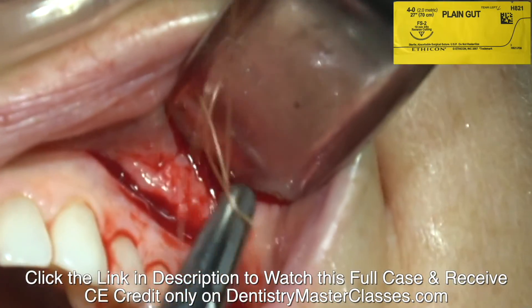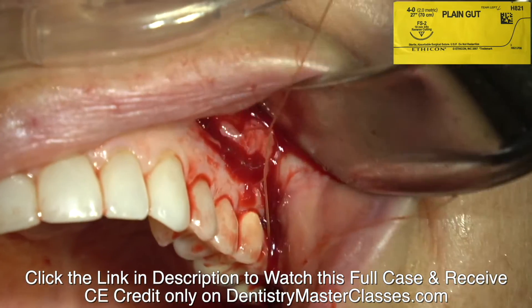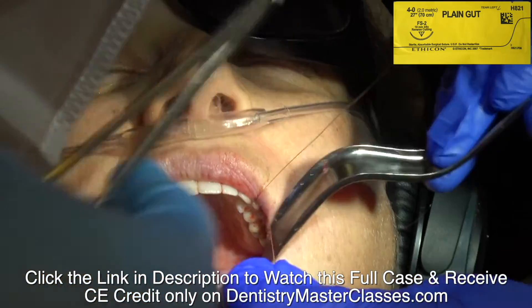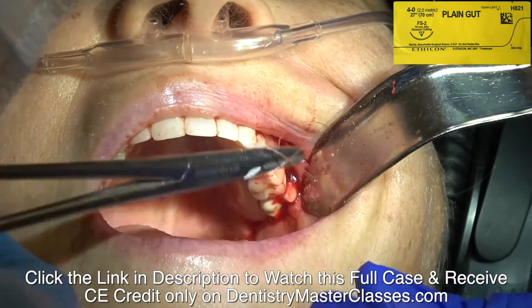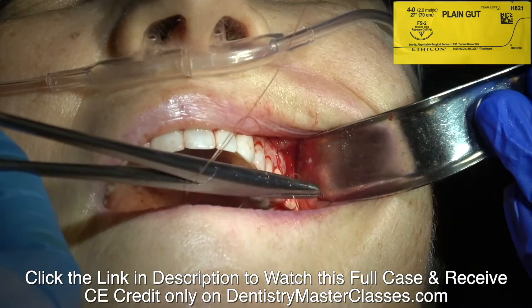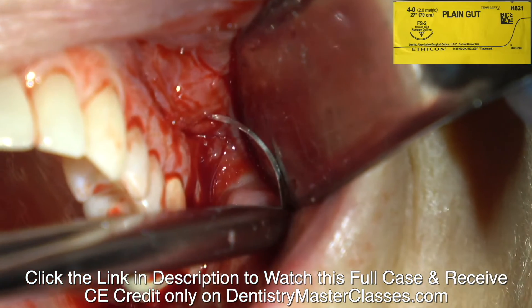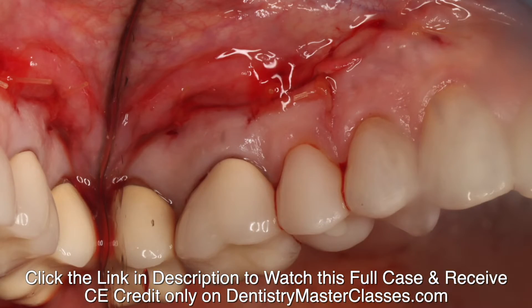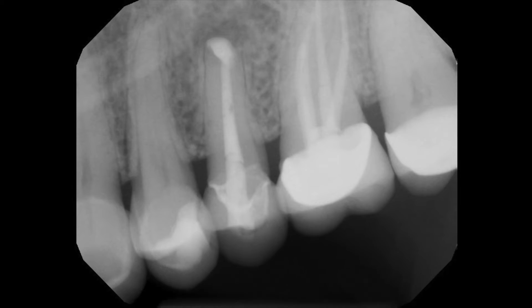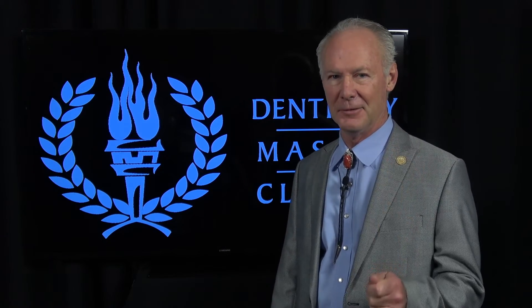It's so great to have a good assistant. Louisa's been my assistant for 27 years; Pam's been with me for 40 years. Having experienced people that really know what they're doing makes life a lot easier. I want to suture that up nice and snug — you don't want to have a bleeding problem. There's the apico. That's the Dental Minute. These techniques work and they work every time.